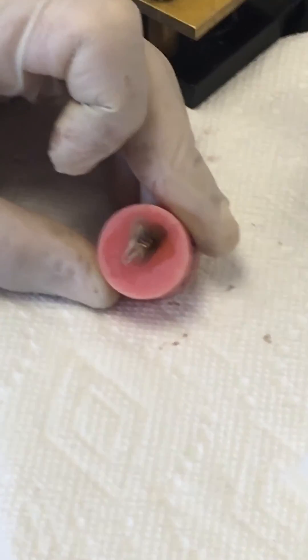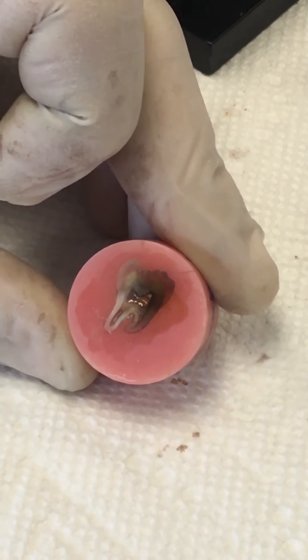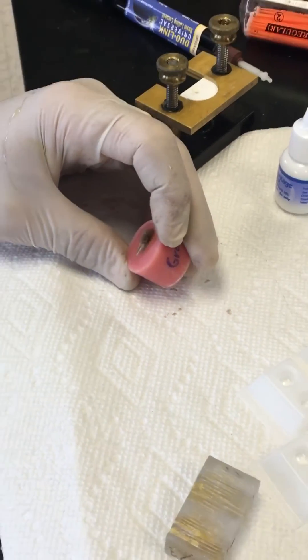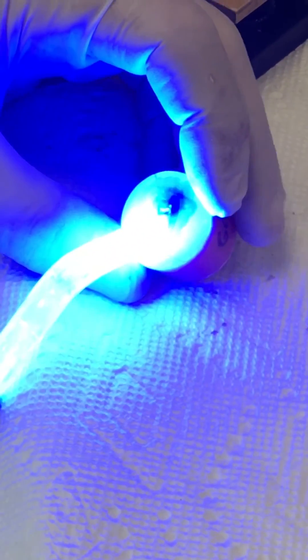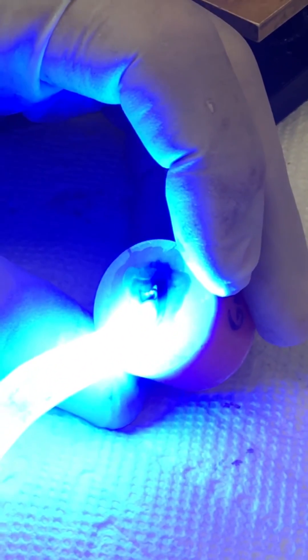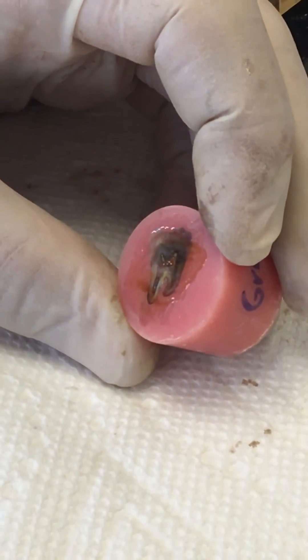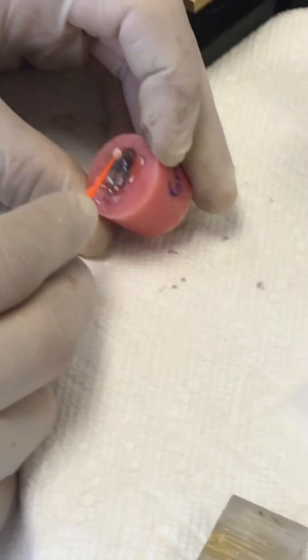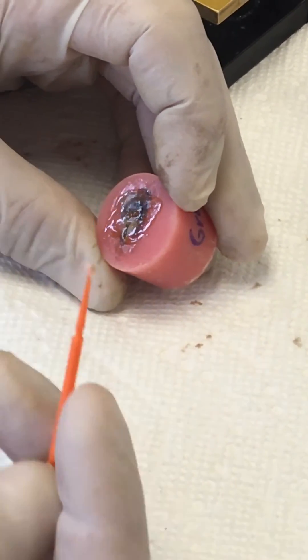Look at that — that is insane. So my question is: is it the adhesive, the interaction? It looks like it's burned. Now I'm going to cure it on this side too, because I applied the silver diamine to the whole surface. So the whole surface turns black. If I take a micro brush and brush this away, it gets kind of funky.